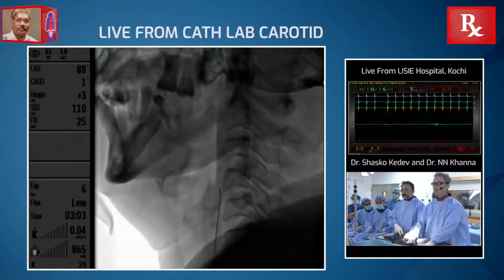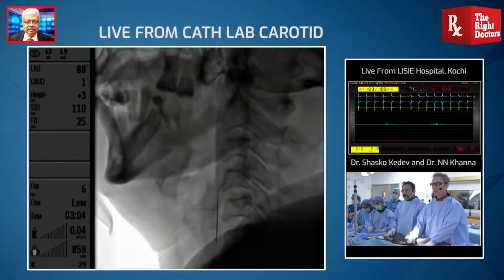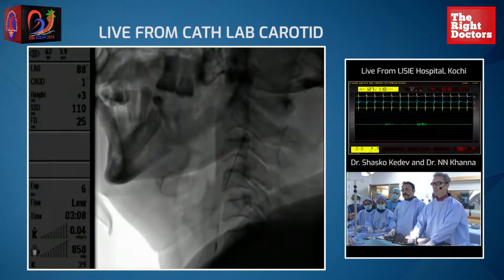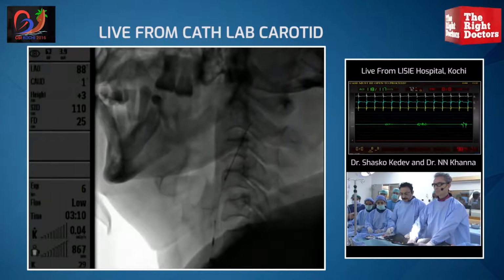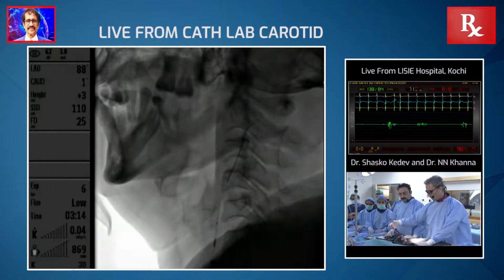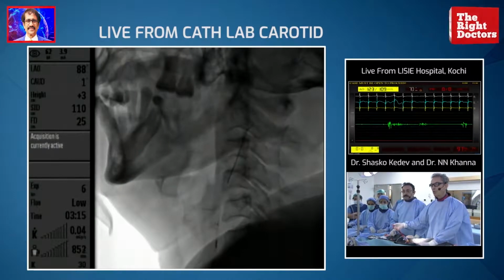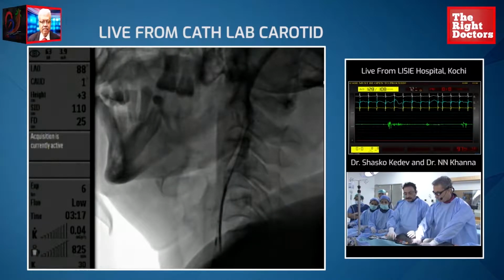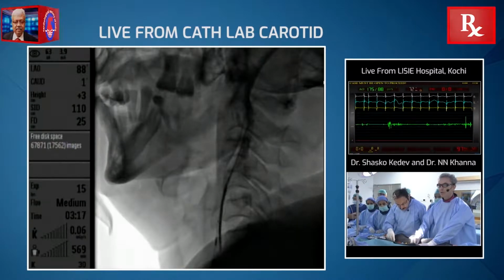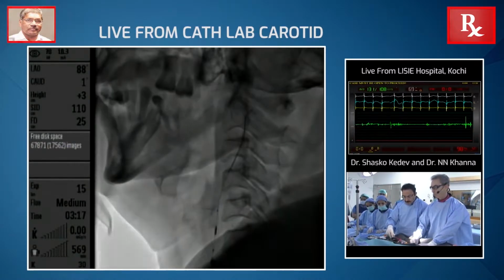So we can go live now. This is the NAV6 protection system. The importance of this system is that it has an independent wire and filter. Particularly in this situation, you can see the advantage of such a system, because the risk of distal embolization is lower and negotiation of very complex anatomy is much smoother.